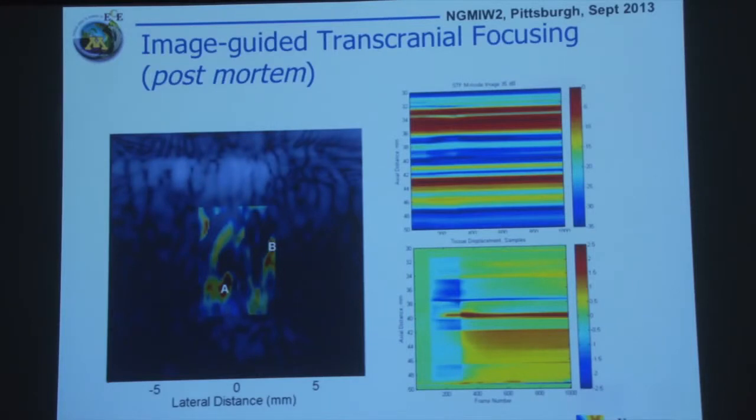And going forward, we'd like to refocus that beam where we want it. As I indicated, in this particular case we're actually trying to go to this point, but the focus shifted. But as you can see, it really maintained its shape for the most part. We do see also, like I said, some additional heating on the side that obviously we hope to correct as we go forward.